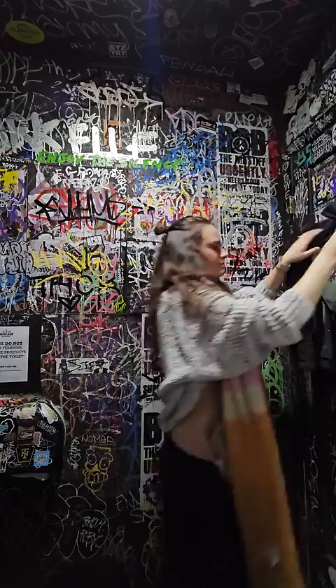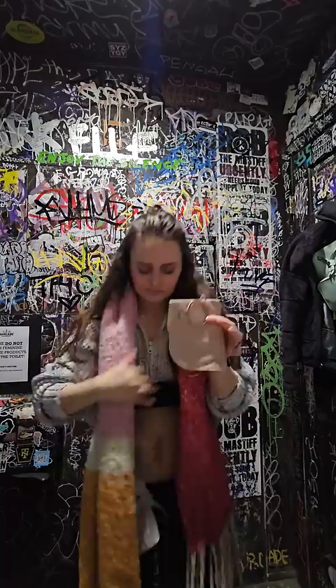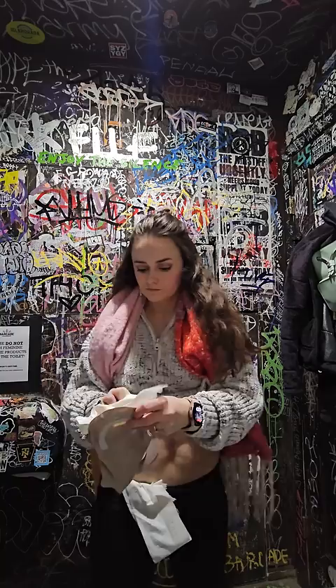Sometimes I will clip on a whole brand new bag depending on the condition of the old one and how many drinks I've had that day. Not today, though. We are going to empty that full bag.